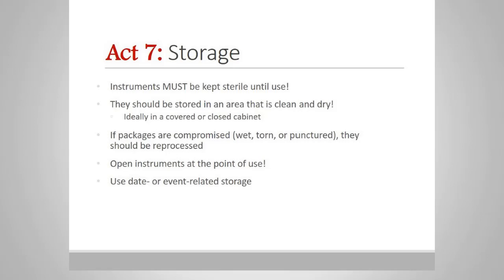I had a dental assistant who was quite zealous and enthusiastic, and one day I saw her setting up for a crown prep the night before the procedure that was to occur at 8 o'clock the next morning. Well, her instrument package was open, all instruments were out, the handpiece was set up, everything was ready to go, and she was out the door because she knew she would be rushed the next morning. Well, I said, that's great and all, but those instruments won't be considered sterile. We need to repackage them, reprocess them, and open them right before use in the morning.